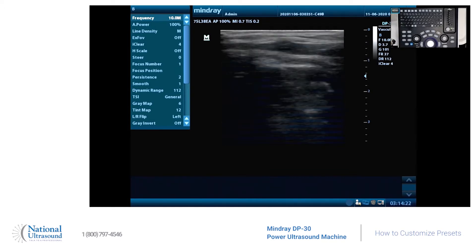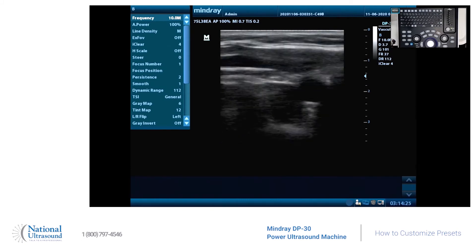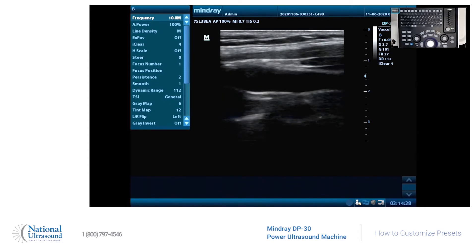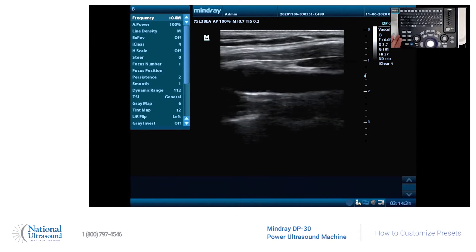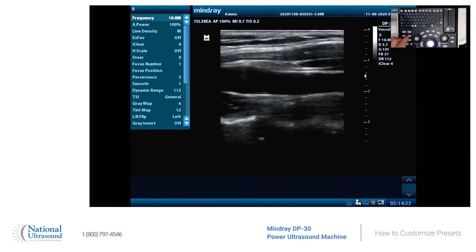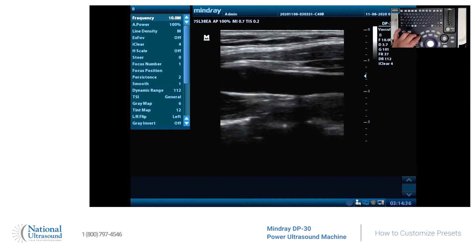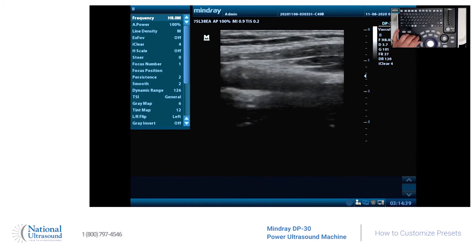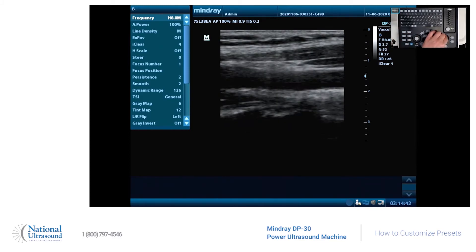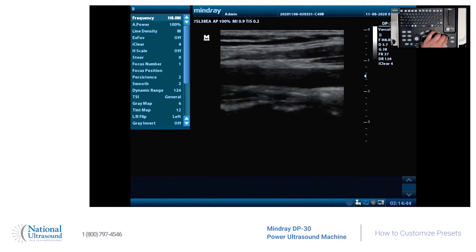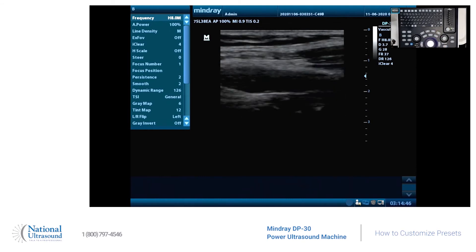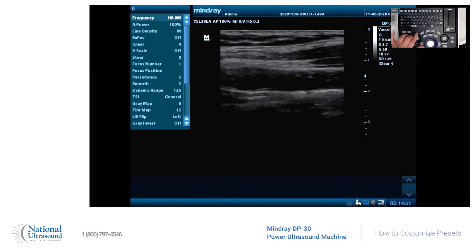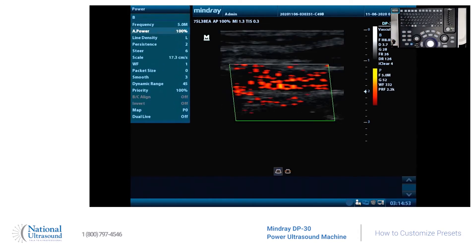With the notch pointed to your right, there's my carotid. So how can we improve this image? First off, I always like harmonics on versus fundamental when I'm doing vascular. Then decrease the overall gain, and let's put Power Doppler on.